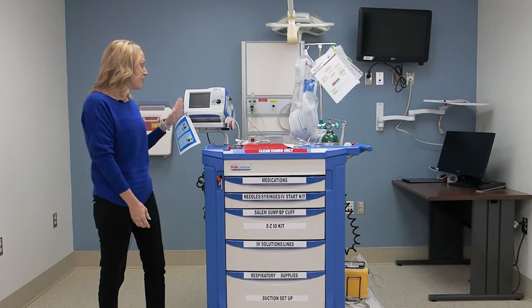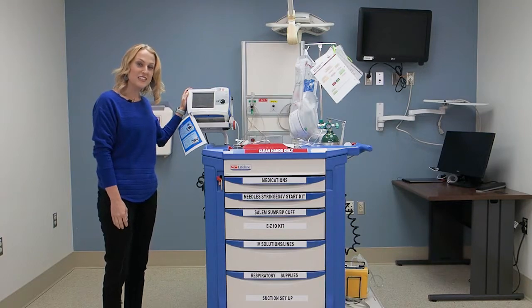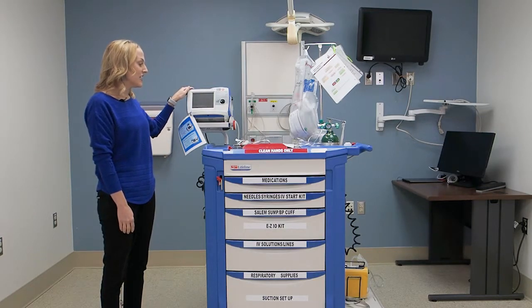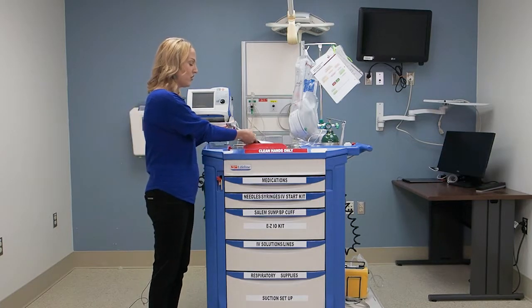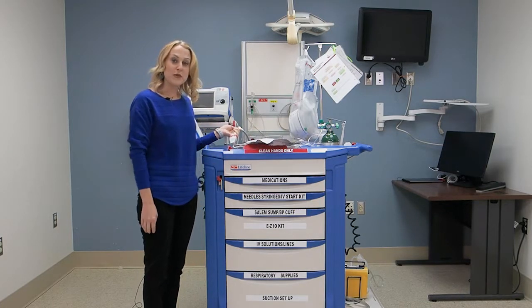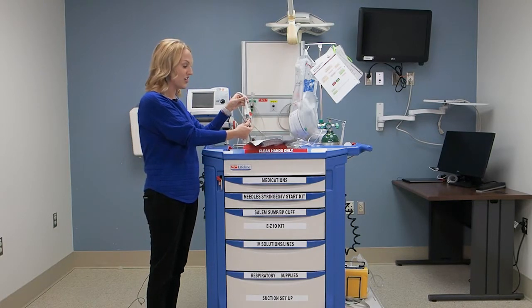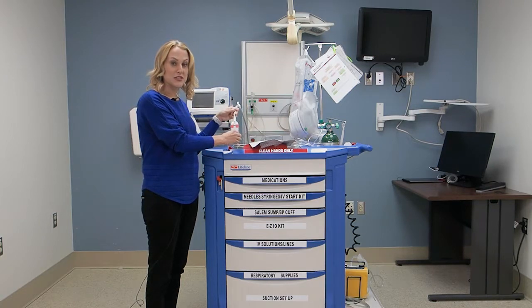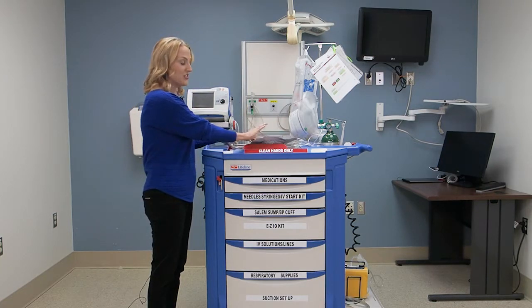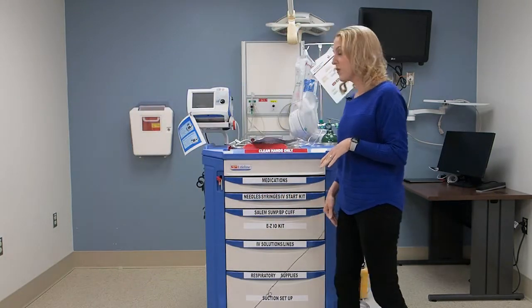We'll first start by looking at the location of the defibrillators. They're all located in the same location, and they are ready for use. On our crash carts, the defibrillator pads are always going to be connected, and you can see the connection here. This allows for immediate use and them to be placed on the patient immediately. So that's one of our features.